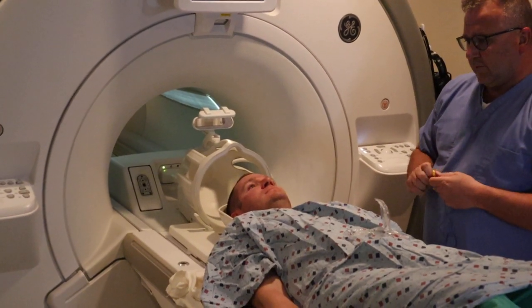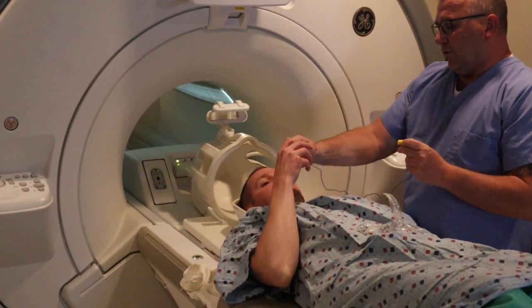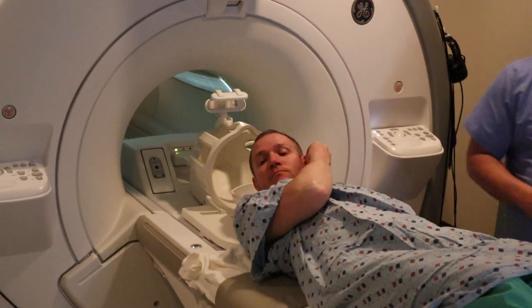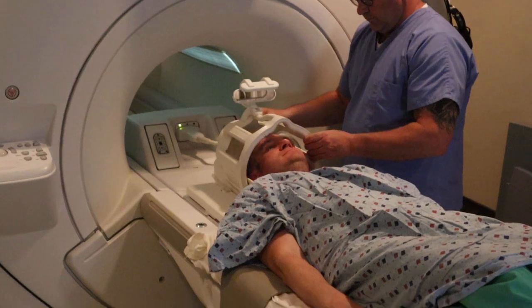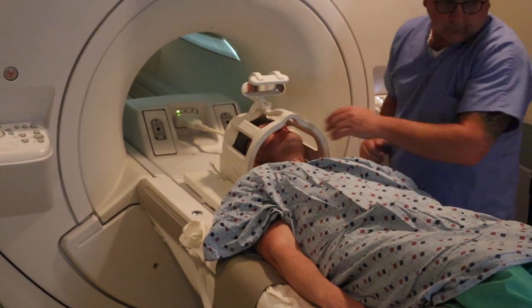If the patient's head is tilted to the left or the right, you need to position your angles at a bit more of an angle. You want a nice and straight position — that means less work and truer images.